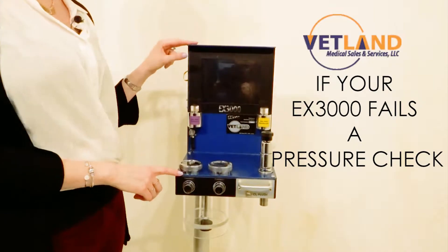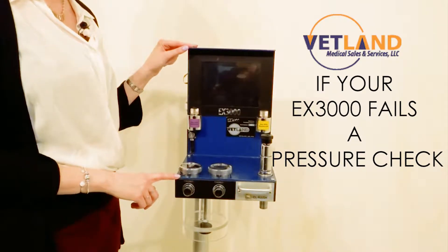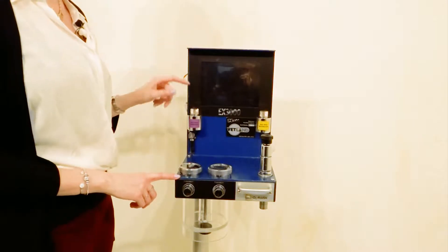There are several different areas of the EX3000 that you can pressure check if you're having a machine leak or a leak that you're unsure of where to find.